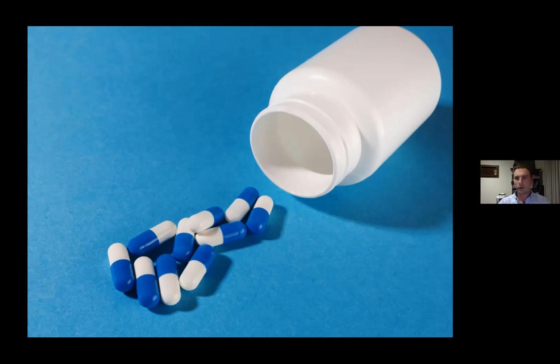What I will prefer to do if I'm dealing with something more chronic is a course of treatment, whether that's a 5-6 session course, and then I'll give the patient a break. I might do a top-up session in a month's time, and then space those top-up sessions out a little bit, as opposed to just weekly shockwaves. I explain it to patients like a course of treatment.